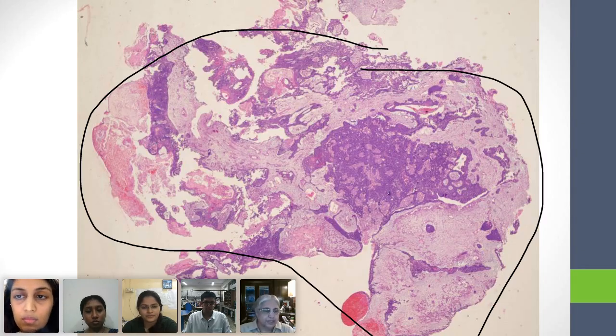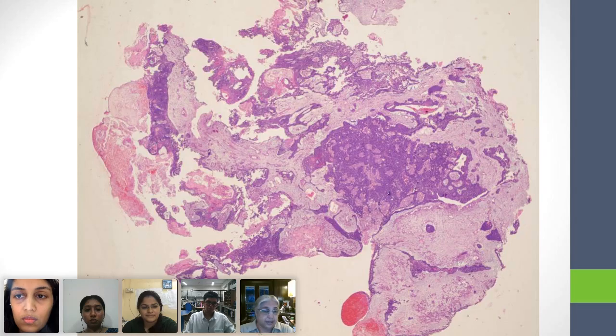Just assume that the something that we're seeing, which made you think that this may be normal, is something that is squamous, right? And you expect that you see some squamous epithelium in the part, and therefore you feel perhaps this is normal mucosa. But I think we have to agree with both Ashish and Neha that it is unlikely that there is going to be much that is normal in this particular tissue. Yes? Neelam, do you agree that there's hardly anything likely to be normal over here?